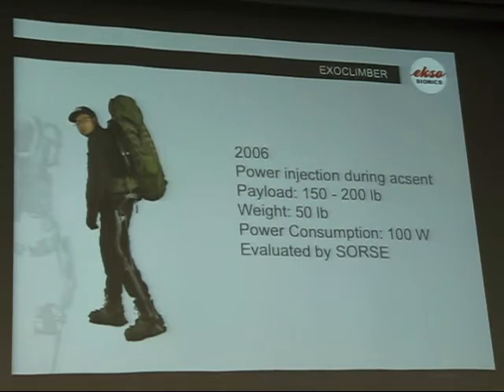We had them both evaluated by the Army, and the Army's metric for efficiency in exoskeletons is metabolic efficiency. What that is, basically, is how much energy a human is consuming, and are you more efficient with the exoskeleton than without it? Both of these devices added mass and inertia to the legs. While they cancel the load you're putting on the back, that extra mass and inertia you're adding to the legs and trying to swing is adding work to the user. It basically feels like heavy boots that you have to walk in. So we increased the heart rate and the metabolic cost of the wearers. So the Army said, okay, even though it does carry and support the load, and it's going to protect the back and knees, it's a non-starter for us because the guy is going to get tired.